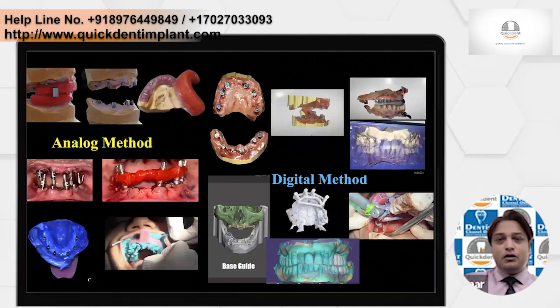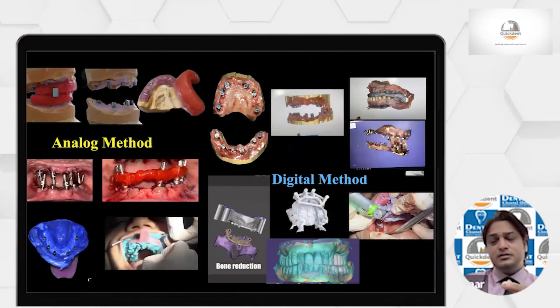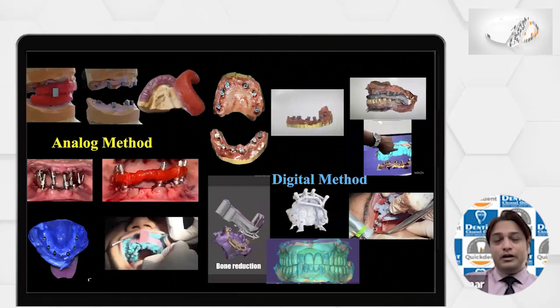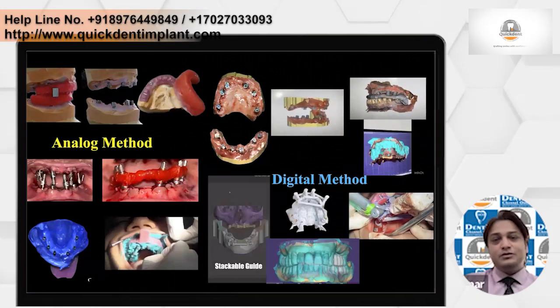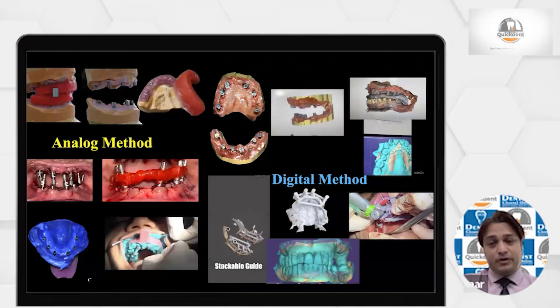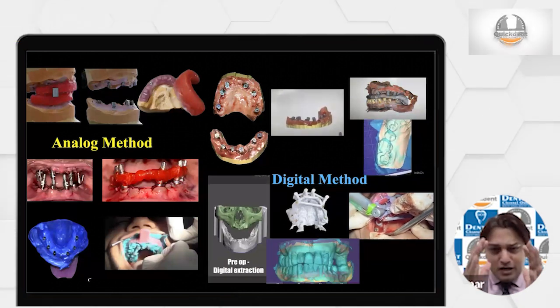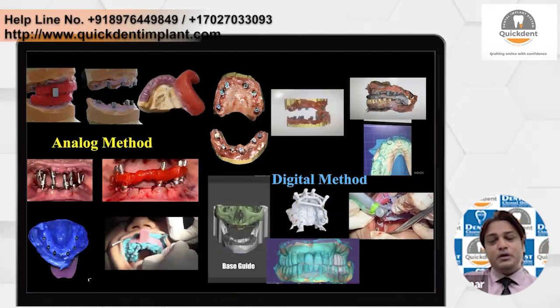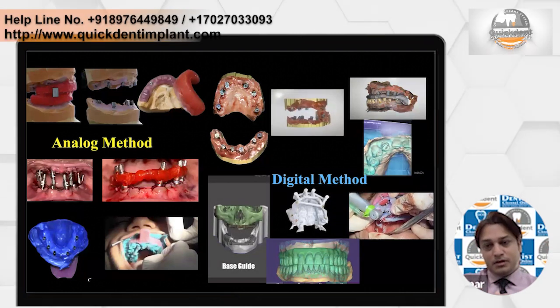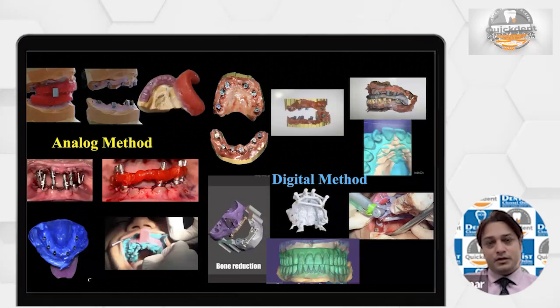So if we come to analog and manual methods, there are advantages of digital methods in some aspects, but every time we have to come back to the analog method. For example, jig verification, which is a very important step, and metal trial, all these things. So unless you have thorough knowledge about the analog method, you cannot jump directly into the digital method. Digital is one of the adjuncts, but it cannot replace the analog method.